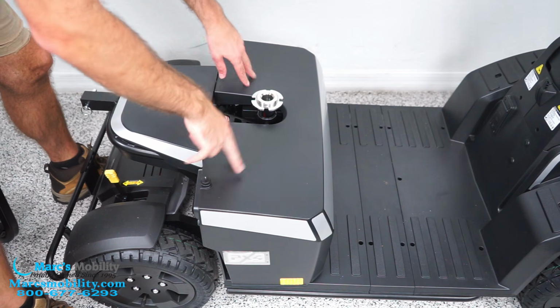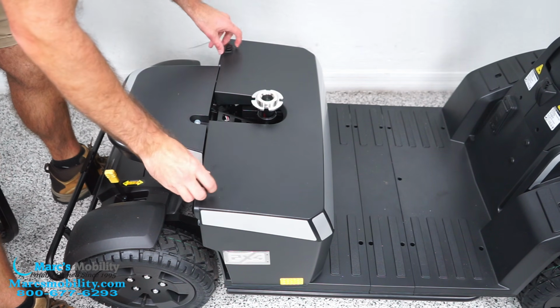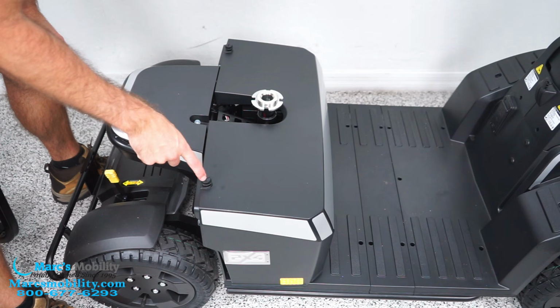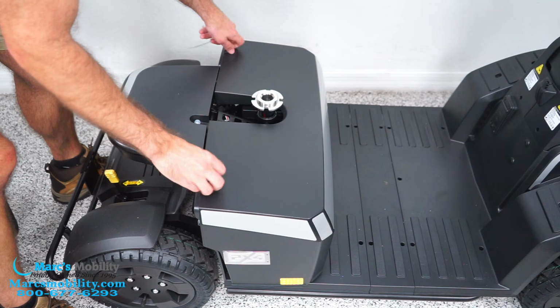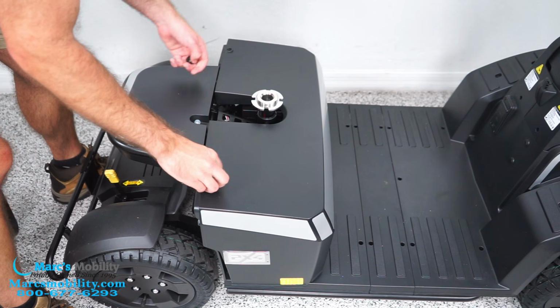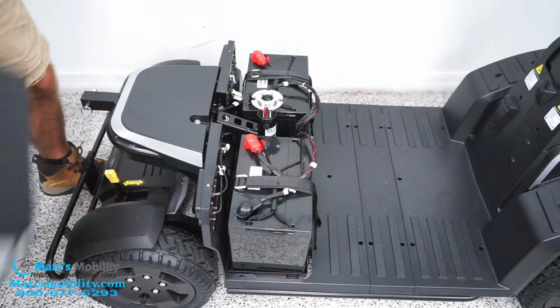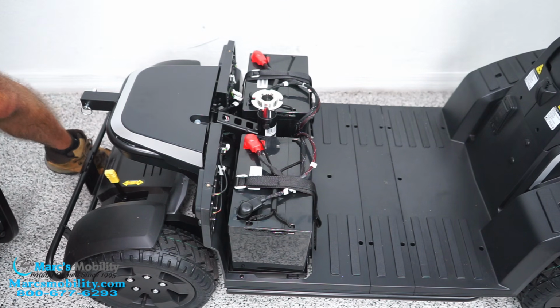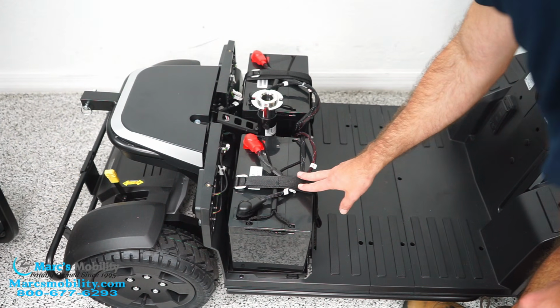Now we're going to remove this battery cover right here. There are 2 screws we're going to loosen. If they are really tight, you can use a flathead to kind of break that seal. Then this pops out, and this exposes your batteries. Now we have access to both batteries.